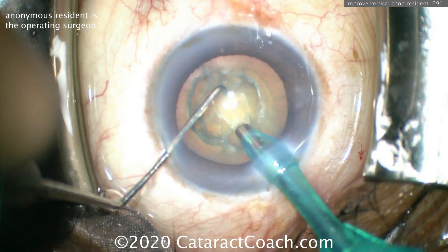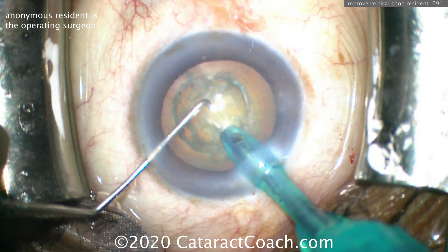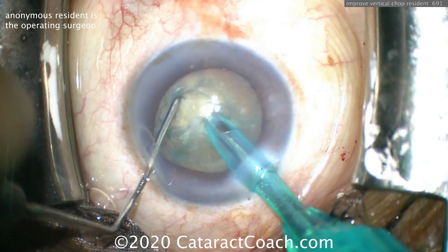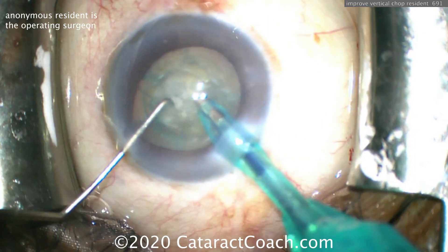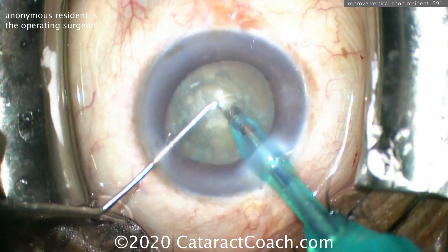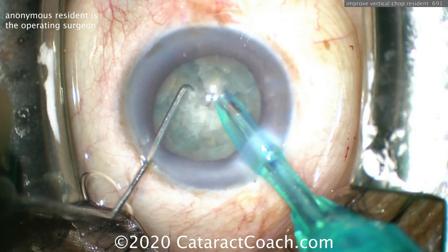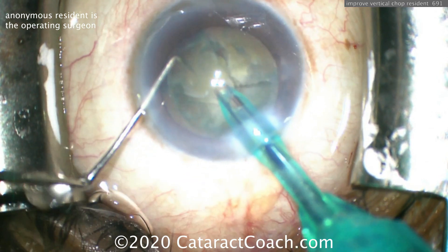There's the chopper placement, and then buzzing in with the probe and chopper going deep inside there. Nice occlusion of the tip — very nice. And the piece can be split. That's pretty good, though it didn't fully split there. I don't know if the phaco probe really has a strong purchase on the nucleus. Let's try that one more time. The goal is to hold the nucleus still by getting a good purchase on it. And that looks better — beautiful. You can see when the phaco tip was occluded and that high vacuum is holding the nucleus still, it became a lot easier to chop.